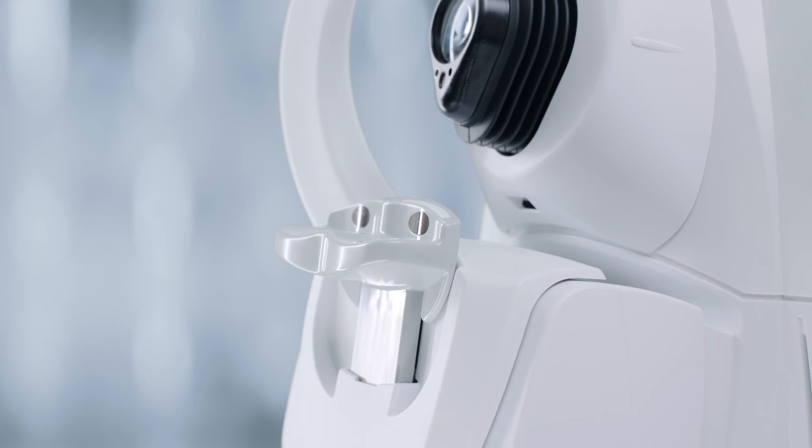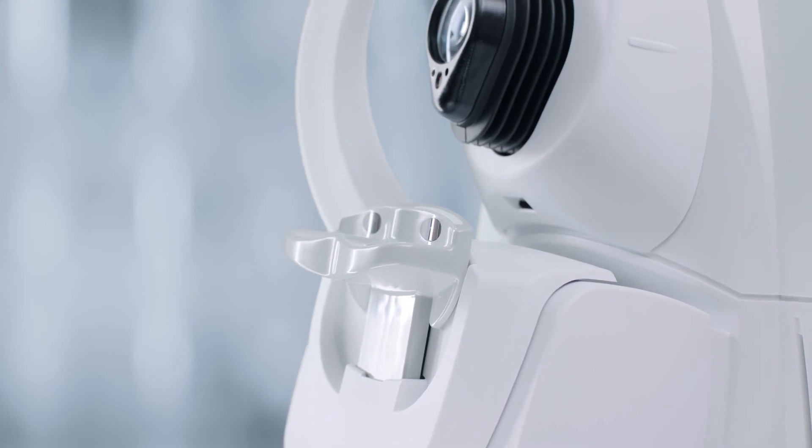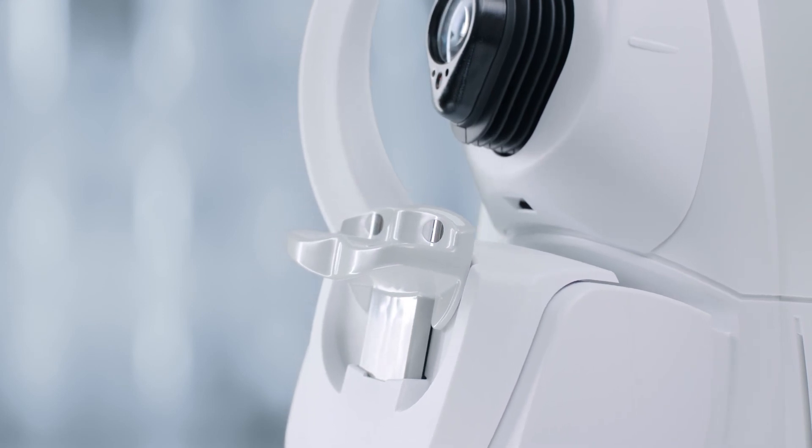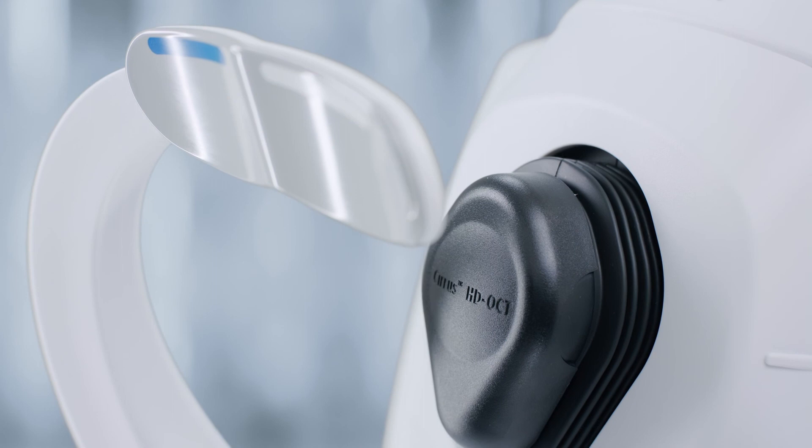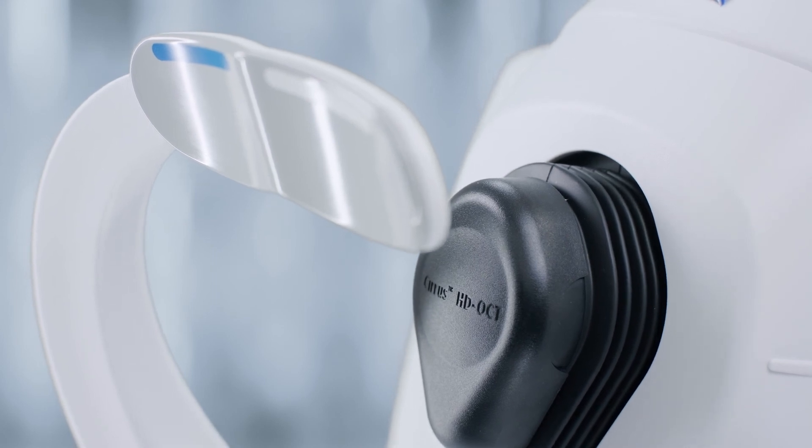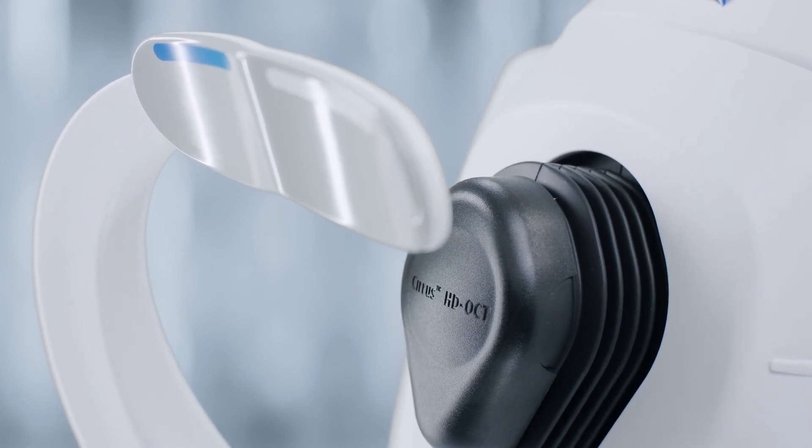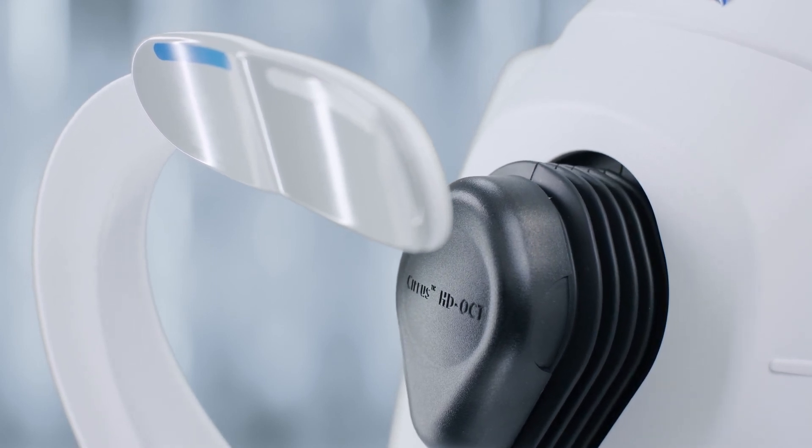Wait until the chin rest's automatic positioning is complete before instructing the patient to place his or her chin on the chin rest. For the right eye, use the blue marked position.